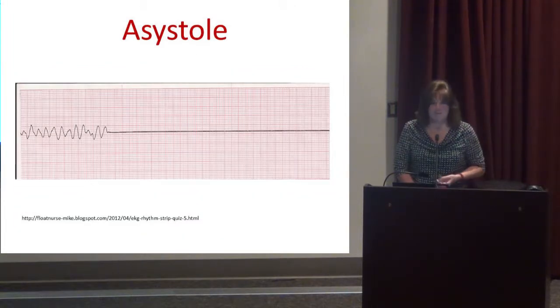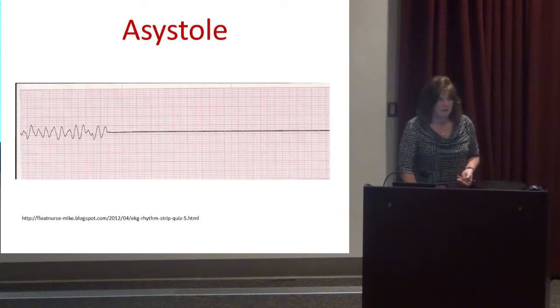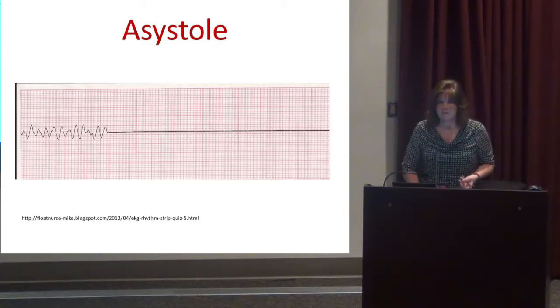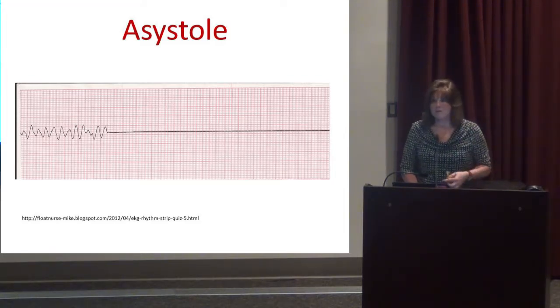Oh, no, this one. Okay, what's the problem here? No rhythm. What do you want to do for this patient? First thing, check a pulse. If they do not have a pulse, CPR. Okay, hard and fast, 100 a minute, deep compressions, until we can sort this out.